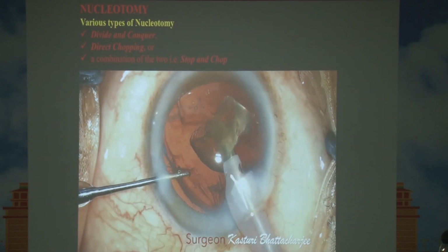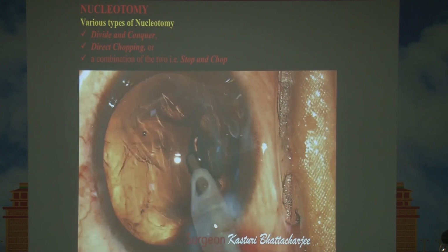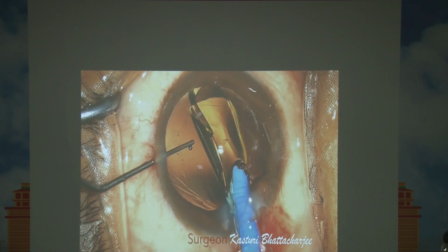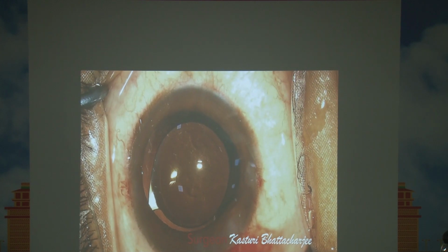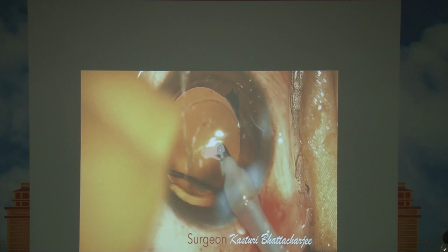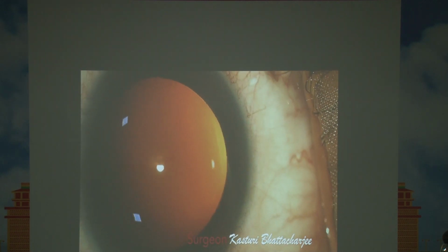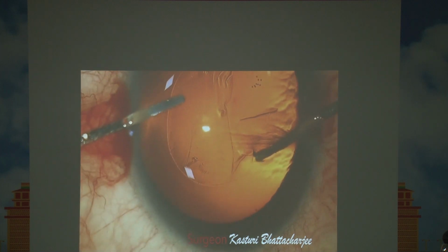But what even today I feel is the most important step for a very successful cataract surgery is definitely a good capsulorhexis. Once you do the cortex aspiration, you implant the intraocular lens, and following the intraocular lens implantation, a very good washout of the viscoelastic. Especially, I usually wash behind the IOL in order to prevent post-operative inflammation or any high intraocular pressure. So this is also another patient where I can show you that the rhexis is very important.